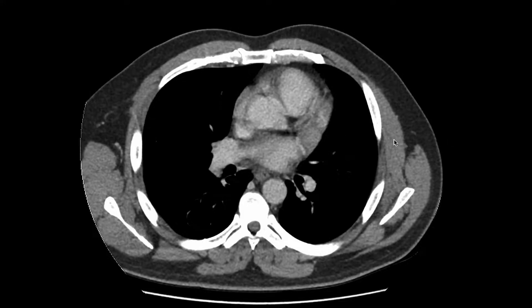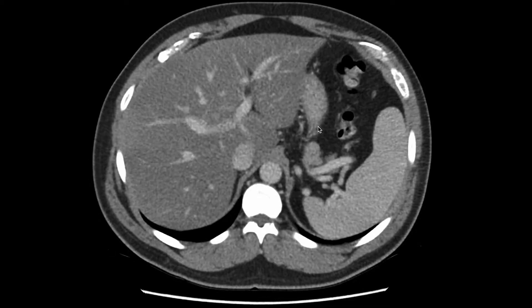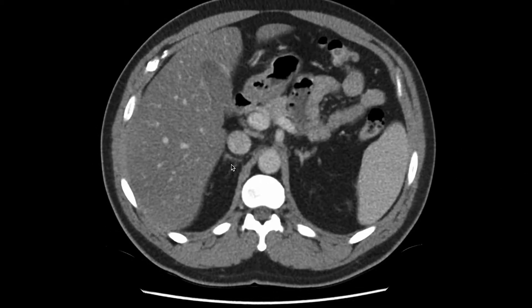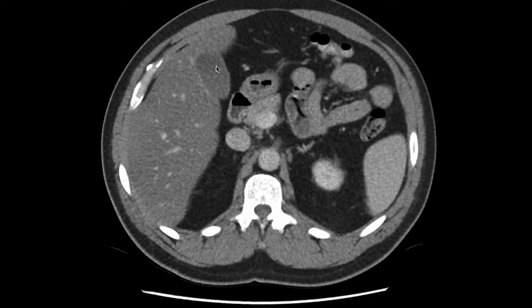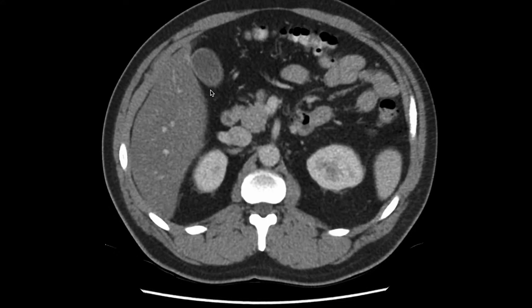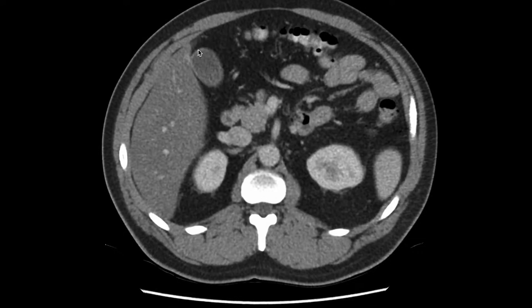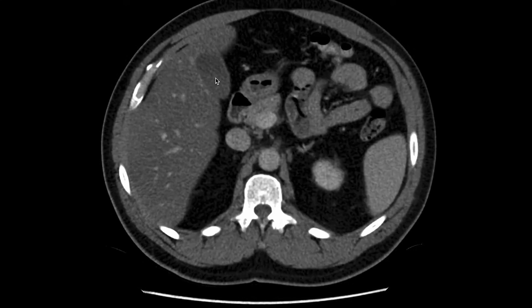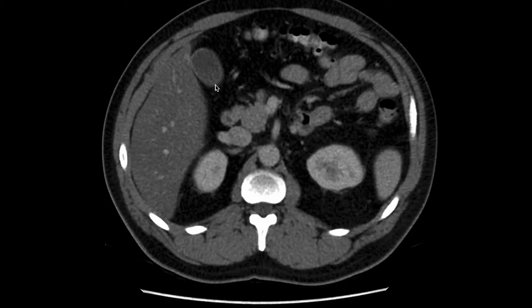Let's start by looking at a normal gallbladder so we can distinguish this from abnormal cases. The following is a contrast-enhanced CT of the abdomen in the axial plane. Scrolling down, we can see the liver on the right and the spleen on the left. Further down, we see a pear-shaped structure in the gallbladder fossa right next to the liver — this is the patient's gallbladder. In this case the gallbladder is normal: it is not distended, has thin walls, and the surrounding mesenteric fat is clean with no stranding. Windowing the study, we look within the gallbladder lumen for evidence of sludge or gallstones — in this case there are none. We can confidently say this is a negative study for acute cholecystitis.